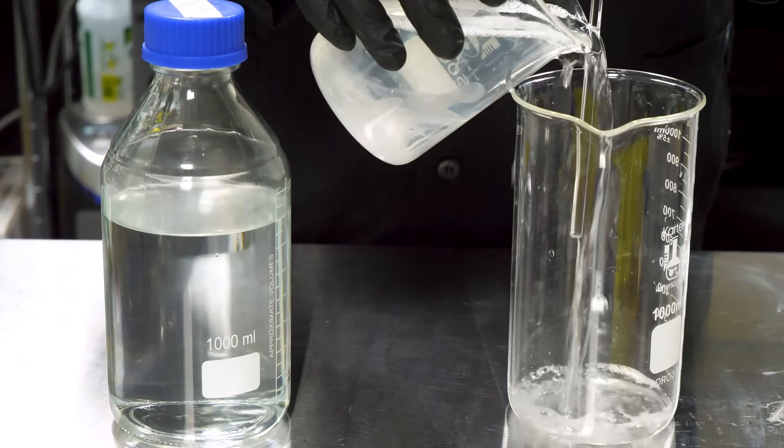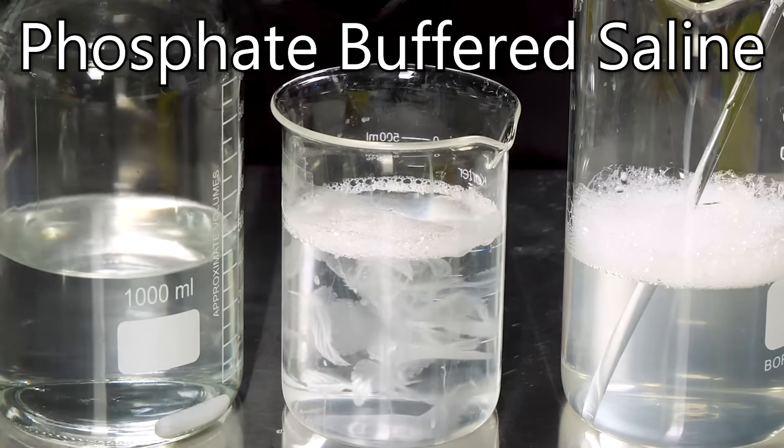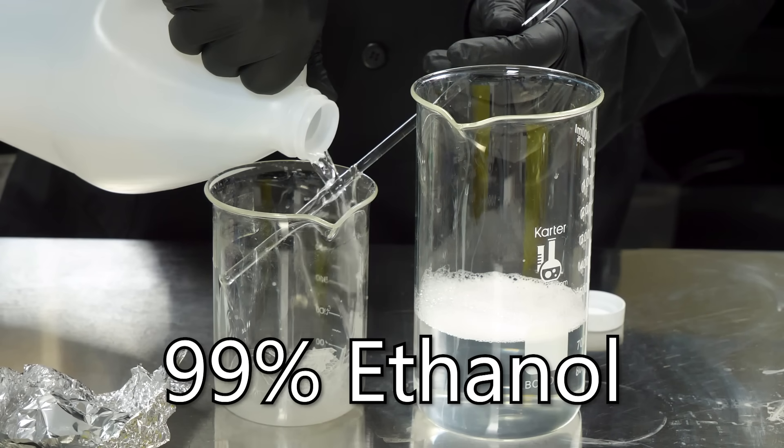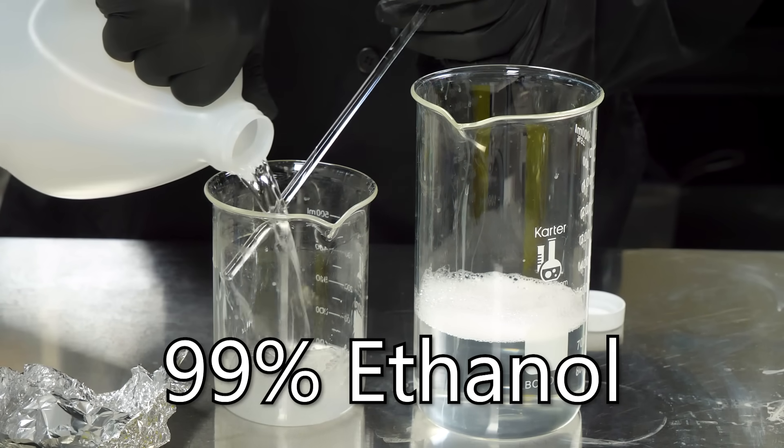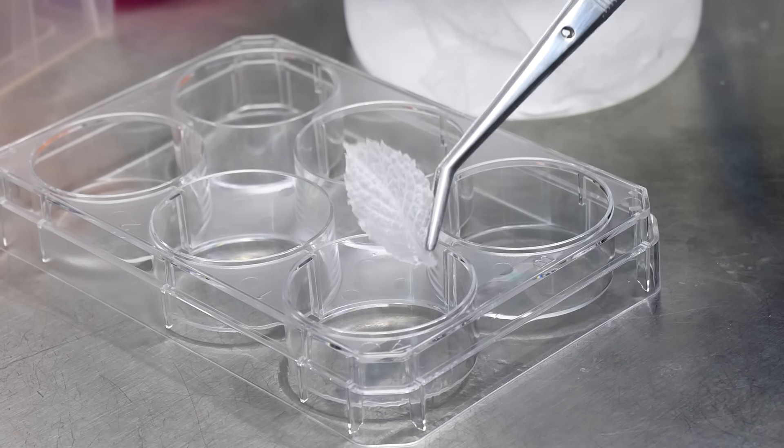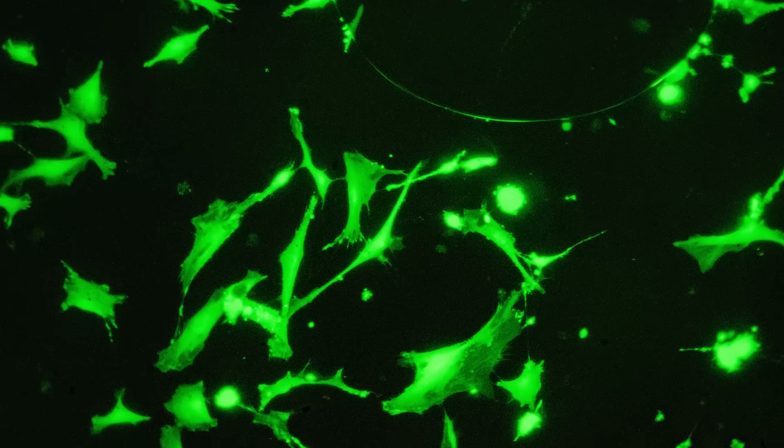To get rid of the excess bleach, the leaves are washed several times with phosphate-buffered saline. Then the liquid was drained, and 99% ethanol was added to sterilize the leaves and preserve them until we needed them. But with that, the scaffolds are done and ready to accept new cells. As I mentioned earlier, we're going to be using fibroblasts.